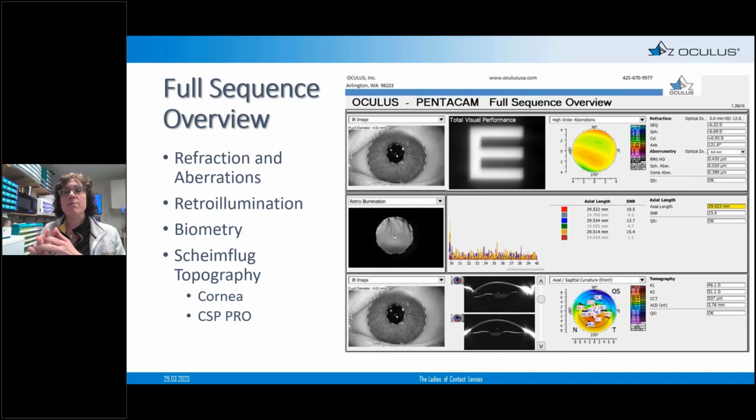On the right hand in the middle of that, you see the axial eye length. This is going to help you with myopia control, but in this particular case, this patient has a very long eye. So you need to be thinking about pathologies that may be associated with very long eyes, such as lattice degeneration or the risk of retinal detachment. Also, you're going to know that this patient's got a longer eye, so that patient's going to be more myopic.